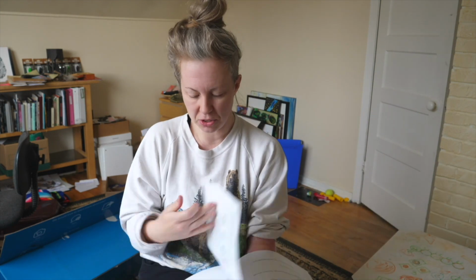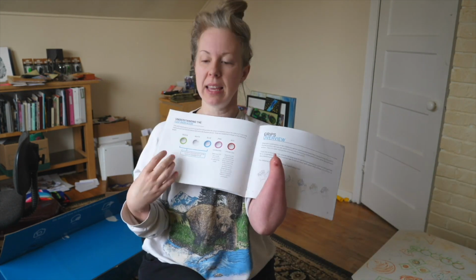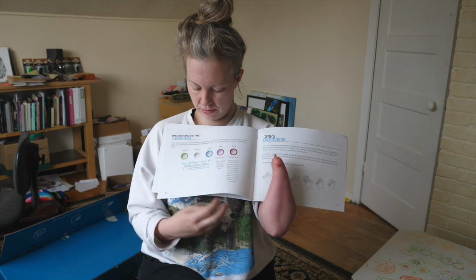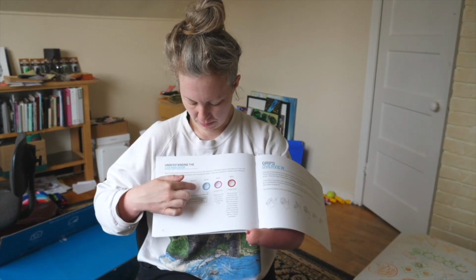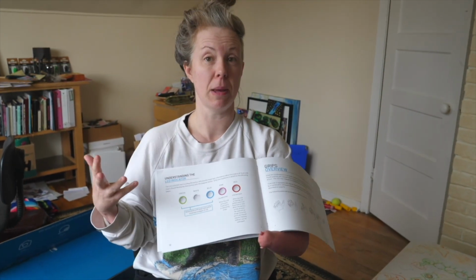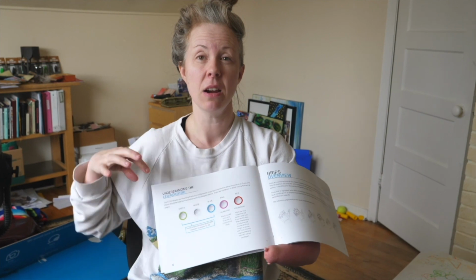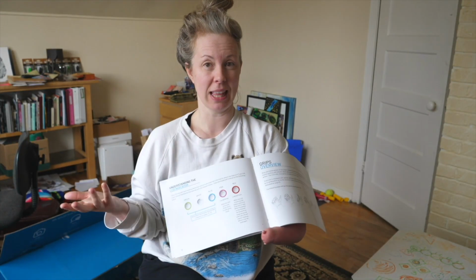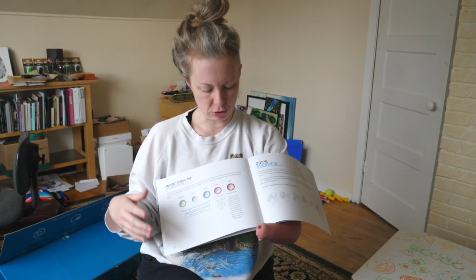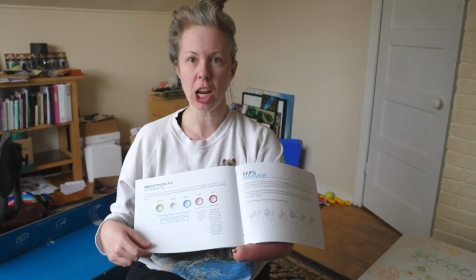And so your limb calibrates and they get all the information. And then you get to run through these different colors. Wait, let me read so I actually know what I'm talking about, because right now I have no idea. What do we do here? So green, white, and blue are different grips. Depending on what color they are, they're associated with different grip patterns. Pink means it's calibrating, so I'll be doing that. Red means the battery life is low, so charge it now.